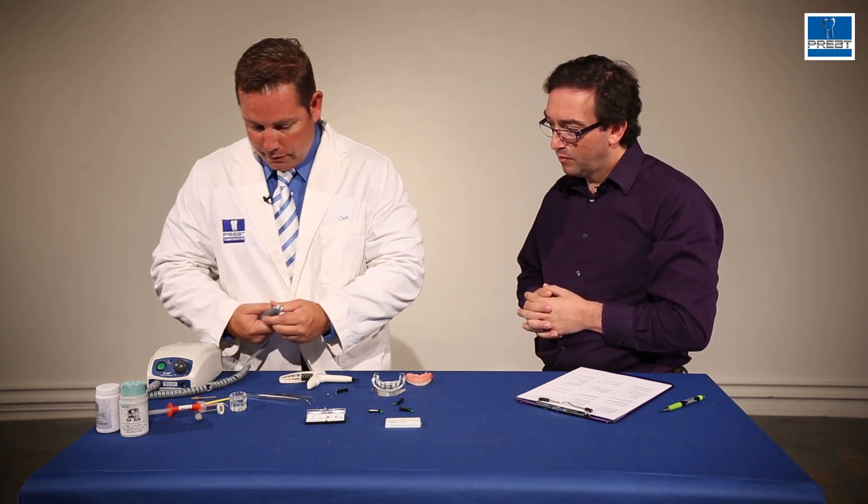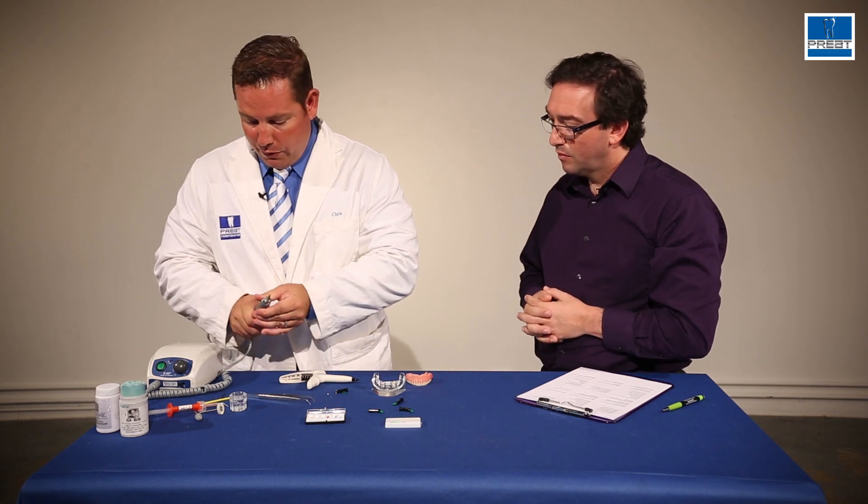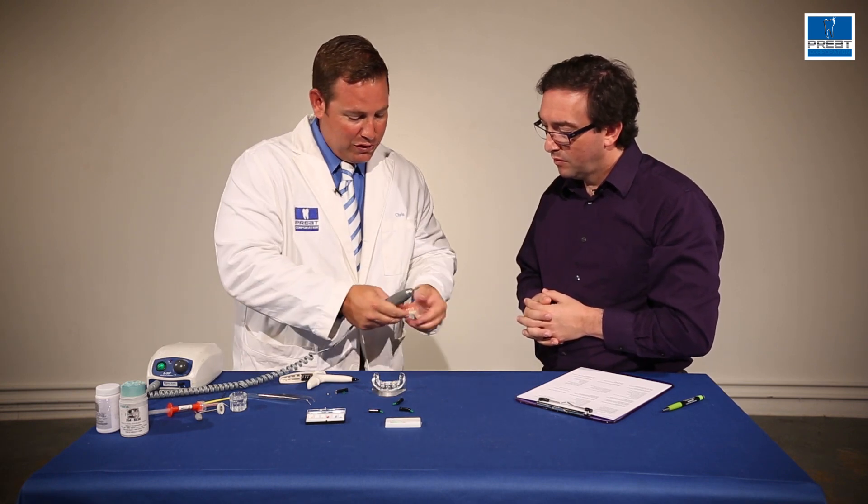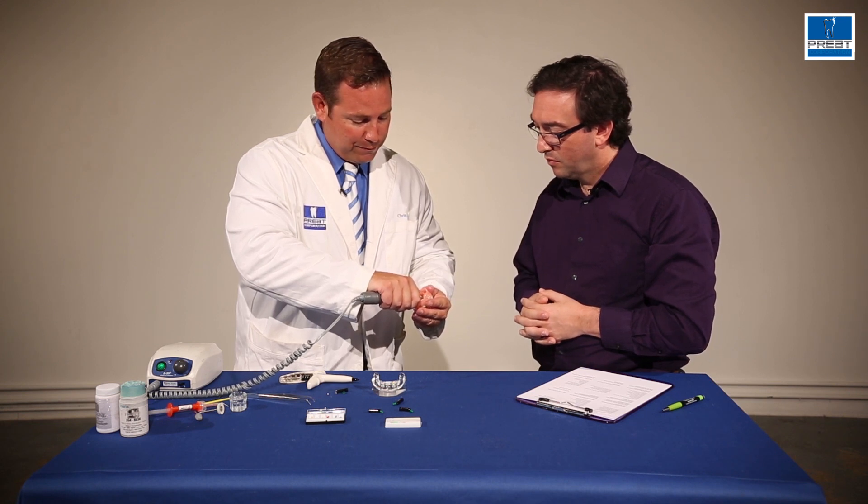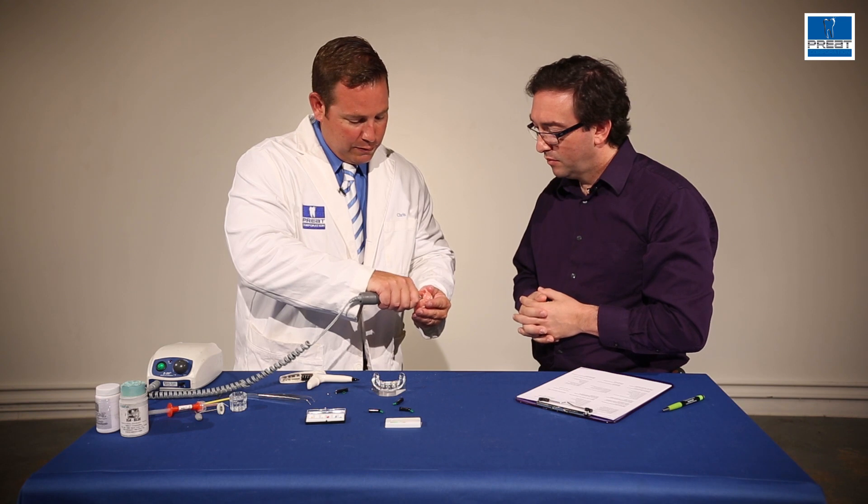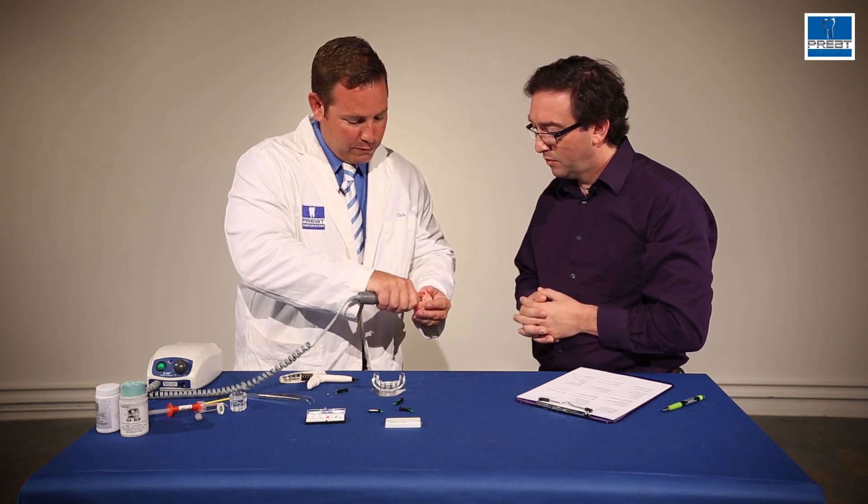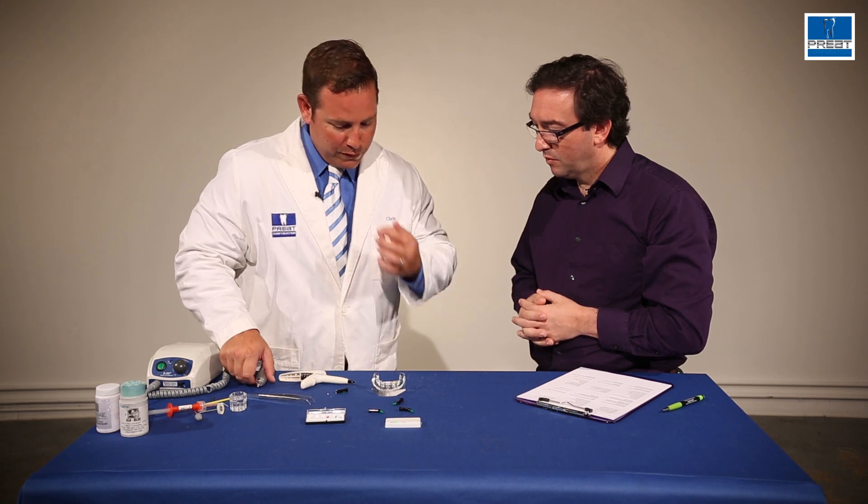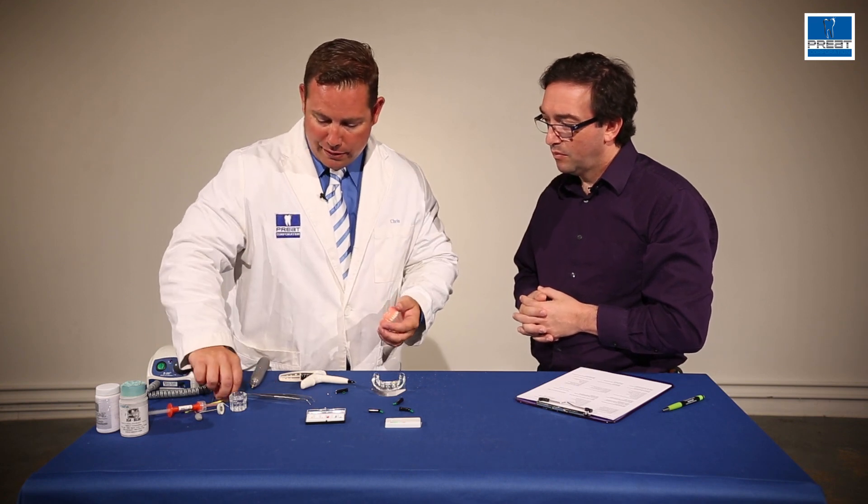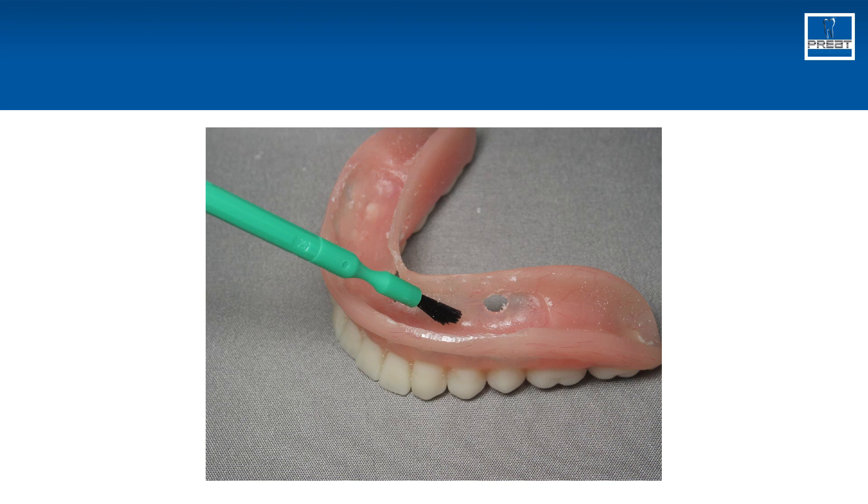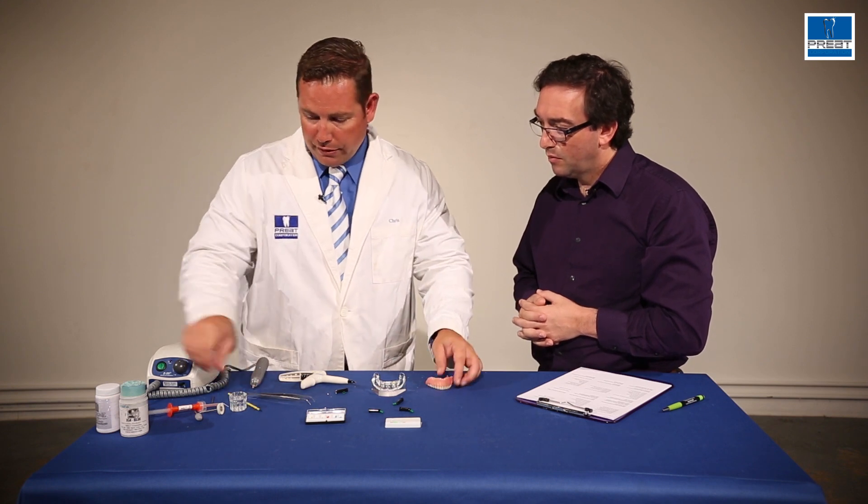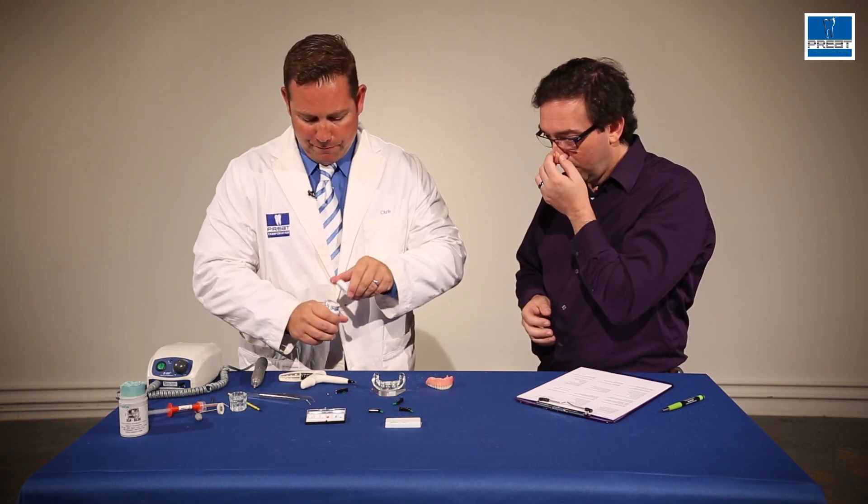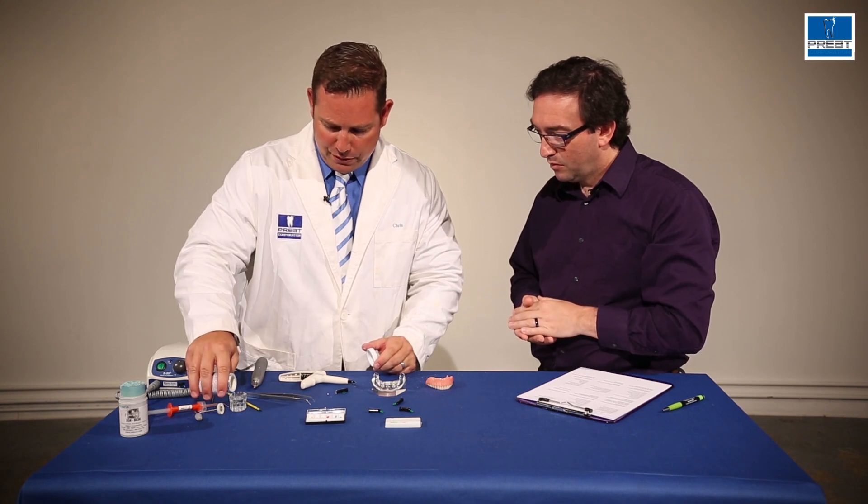At this point, I'm going to come in. I've already relieved sufficient space inside the denture where I want to pick up the clips. I'm going to take my brush again, paint a little bit of monomer to the area I want to add acrylic. And at this point, while I let that dry, I'm going to mix up a little bit of self-cure resin here.